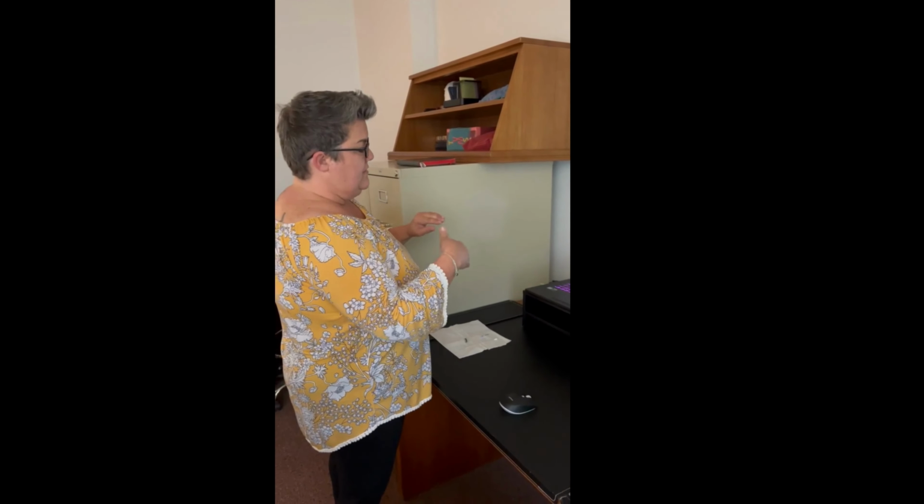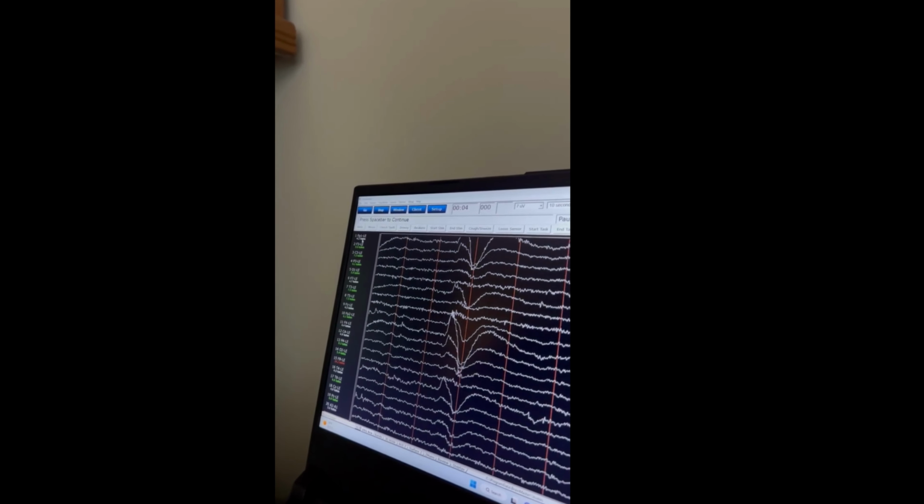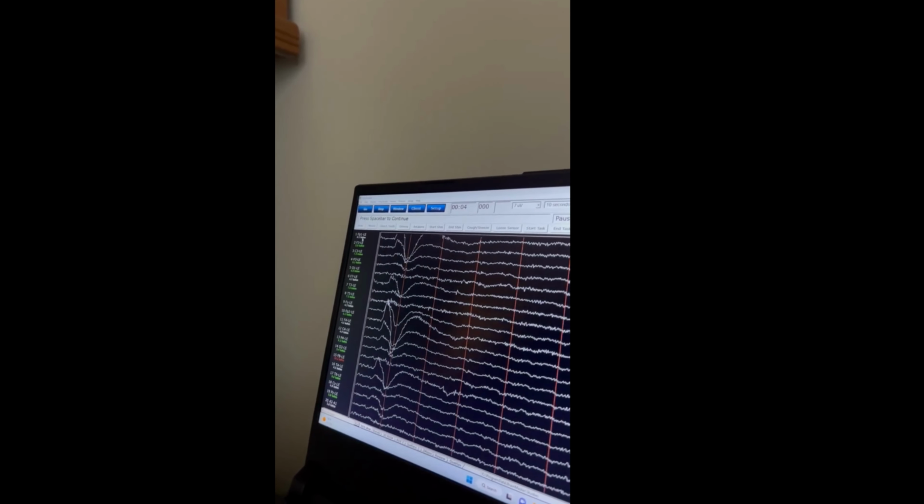and so you have a live active session. The second thing you want to do is come over to this left-hand side. We have these numbers underneath your sites. This one says 4.0, and this is K ohms. Ohms is measuring the resistance of signal running through the wire. So you want to have the least amount of resistance, which means you're getting the best flow of signal from the brain to the amplifier.